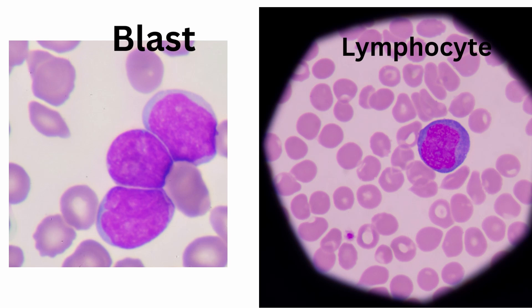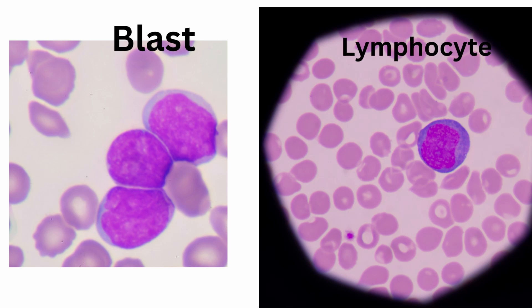I've got some blasts and lymphocytes side by side. As I was saying before, if you look at the chromatin pattern on the blast it's very smooth and lacy compared to the lymphocyte on the right. And with the NC ratio, you've got a lot more cytoplasm on the lymphocyte than you do on the blast on the left.